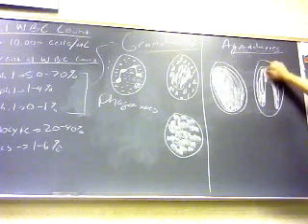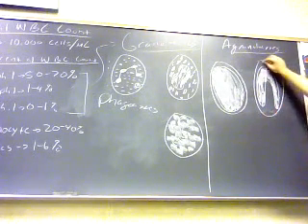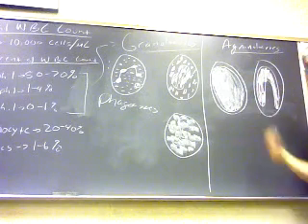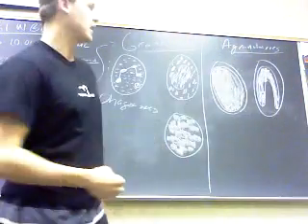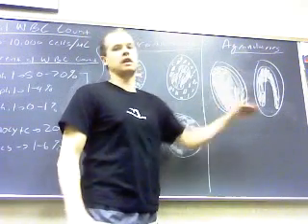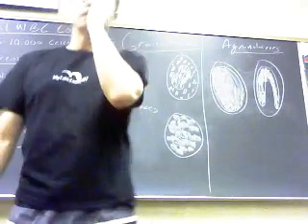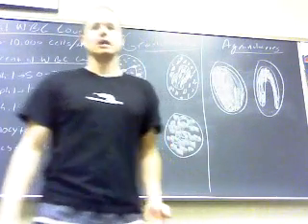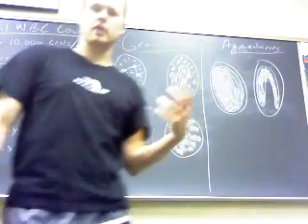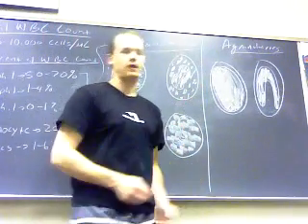Their nucleus is shaped like a horseshoe, fairly easy to see. Again, you may see some fine granules in the cytoplasm. Now basically, a monocyte is a circulating phagocyte. These are phagocytes circulating around in the blood, and they're trying to go somewhere, because eventually these will be stored in different tissues throughout the body, and they take on different physical characteristics, and we name them differently depending on the tissues you find them in.